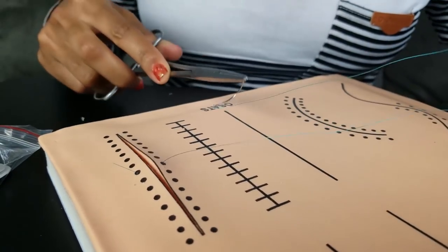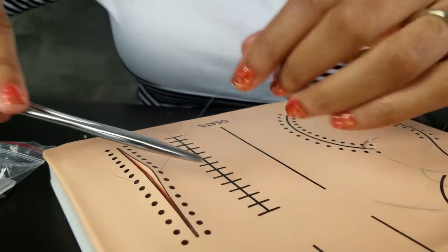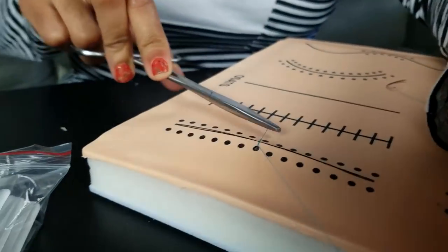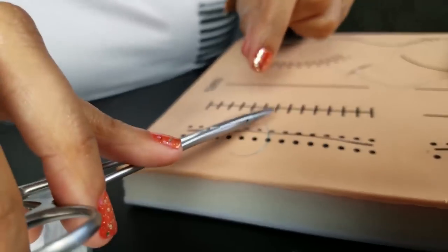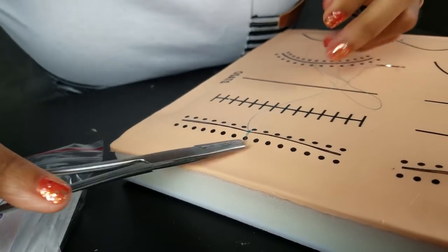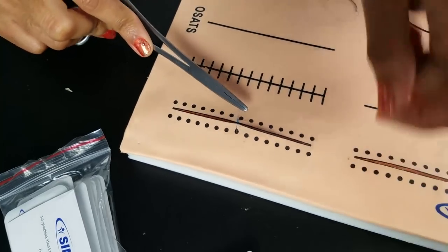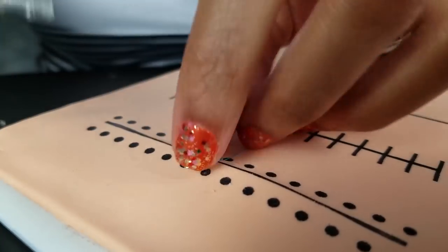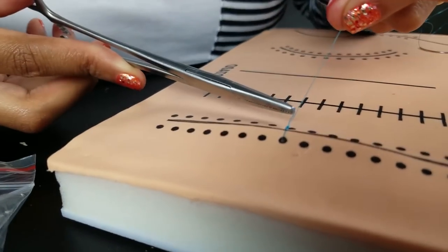I'm gonna use my fingers to kind of finish this off because it's just easier for me, but you do the two double, pull it through, make sure that it's flat, is what I was taught. You have that kind of flat stitch. You throw it once again, pull it through, and throw it one last time, and you pull it through. And then you'll take it, obviously, and you'll cut it, because that's the interrupted part of the simple interrupted.